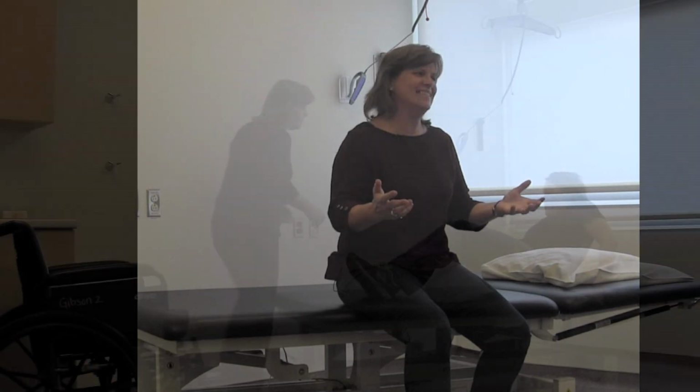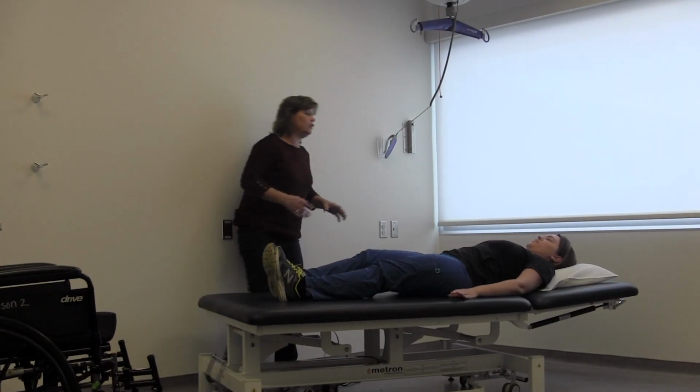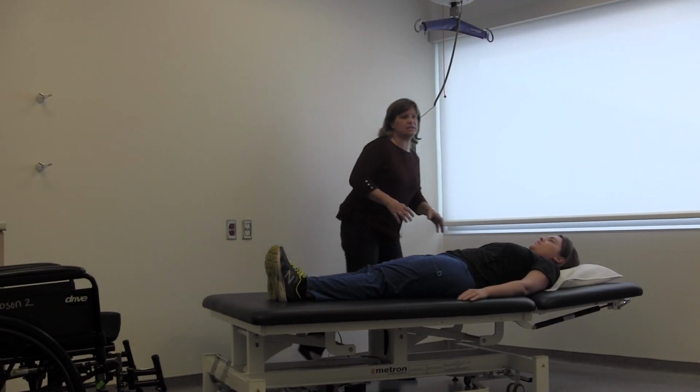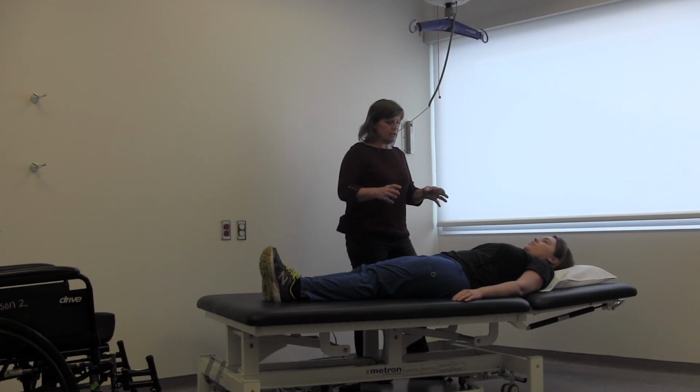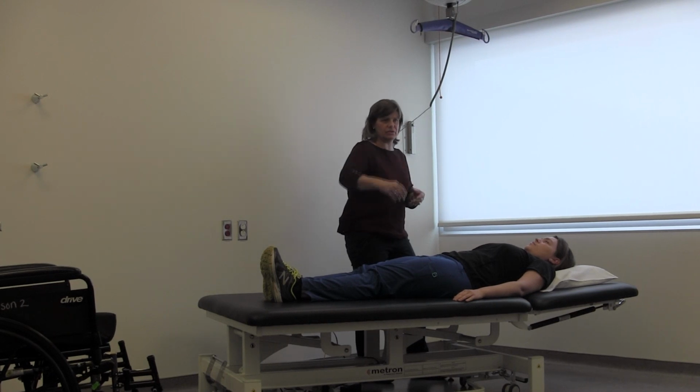So I need a volunteer. Annette, would you help me out? And we're going to say that your affected side is her right side at this point in time. The reason we're doing that is so that I can be on this side and I can show you, and then we'll move to the other side for the rest of it, okay?